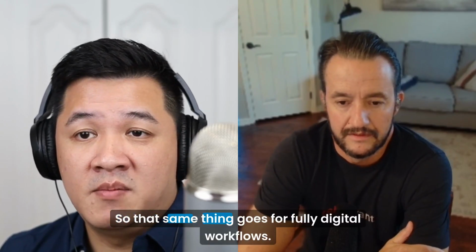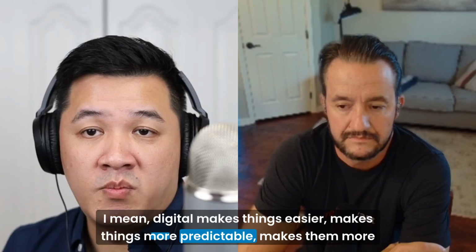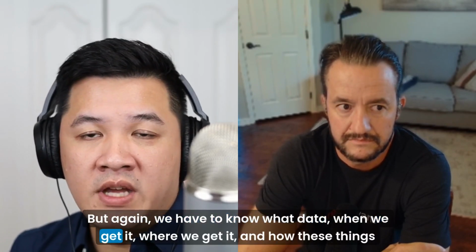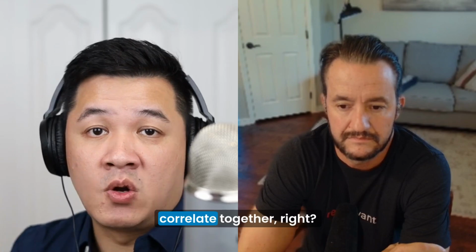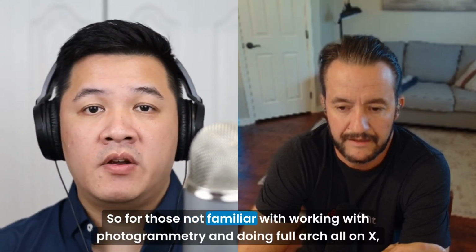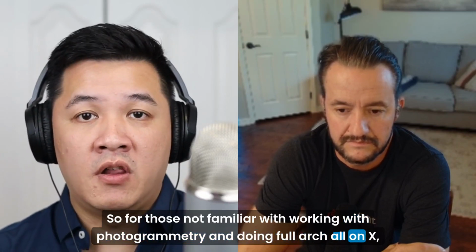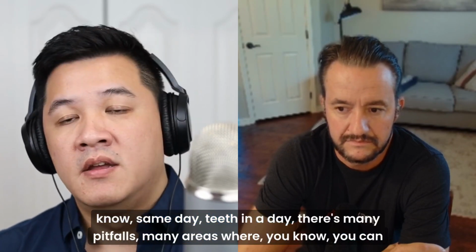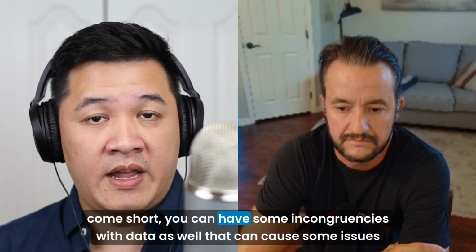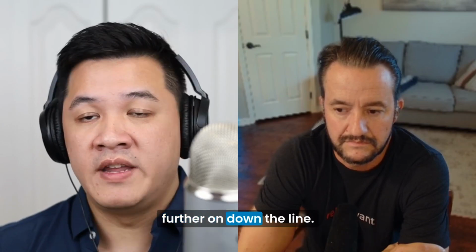The same thing goes for fully digital workflows. Digital makes things easier, more predictable, more efficient. But again, we have to know what data, when we get it, where we get it, and how these things correlate together. For those not familiar with working with photogrammetry and doing full arch all-on-X, same day, teeth in a day, there are many pitfalls, many areas where you can come up short. You can have some incongruencies with data as well that can cause issues further down the line.